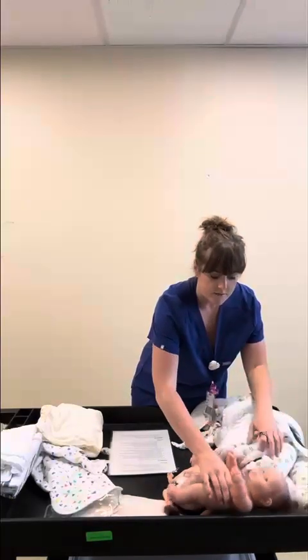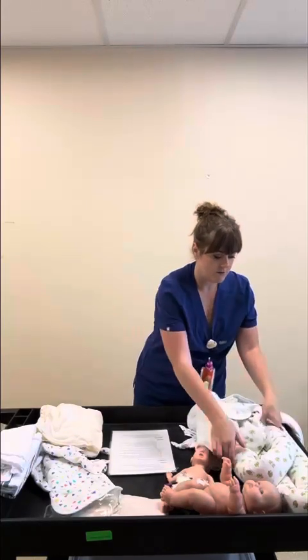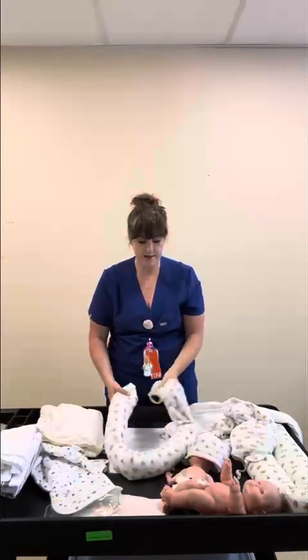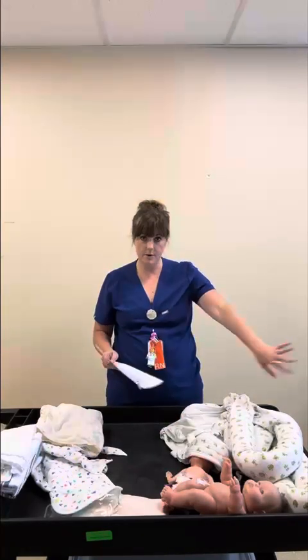This baby now all of a sudden needs to go on bubble CPAP because he's having some respiratory issues. Do you still have to follow safe sleep guidelines, or can you start using positioning devices? You can start using positioning devices. So you might grab one of these guys to make sure that they have boundaries, and you don't need an order anymore because they don't qualify for safe sleep with that respiratory equipment. But once they get better, you have to remember to take it away.